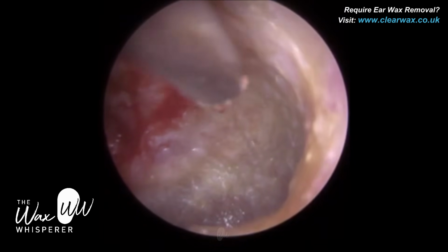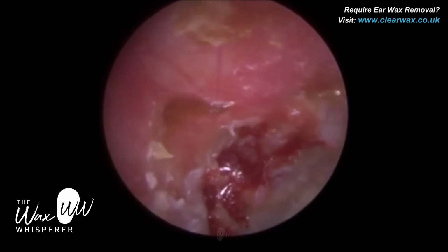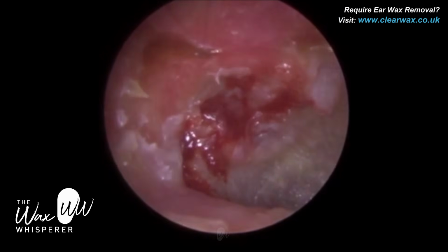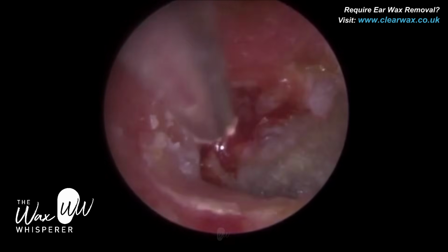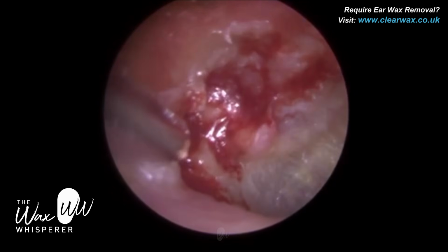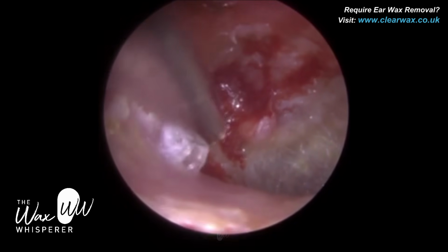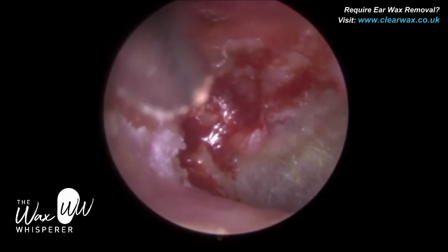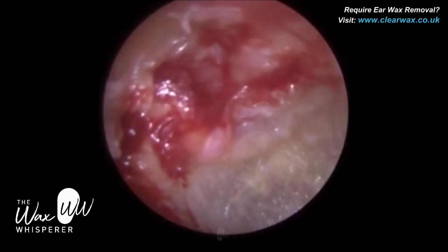And again, I'm just touching this, I'm just trying to evaluate what's going on here. And you can see it's a bit of a swelling there, so I'm leaving that. I'm happy with what I've done. And the patient was comfortable throughout. So at all stages, I was just trying to make sure the patient was comfortable, because if the patient wasn't comfortable, I would have stopped immediately. Because it's hard to tell whether this cholesteatoma was quite deep into the middle ear. Because the patient tolerated the procedure very well, I could be rest assured that it wasn't, and it was more externally in the outer ear at this stage.